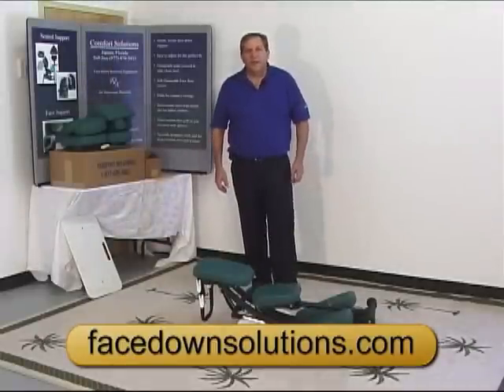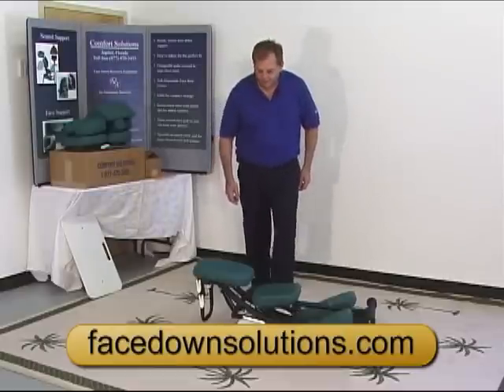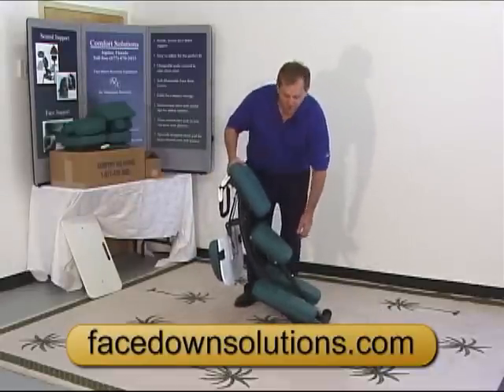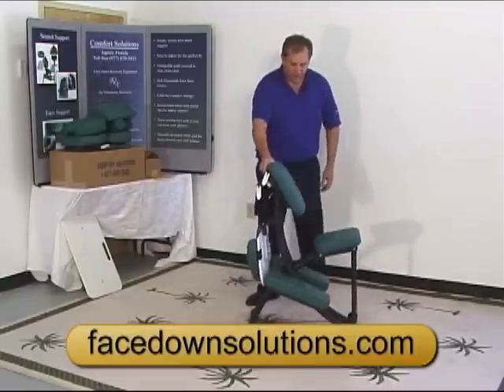Hi, Tom Russo with Comfort Solutions. I'm here to show you how to work with the chair now that we have it all unpacked. First thing we need to do is open it up — quite simply done, just lift it up, lean it forward, and lift up on the back of the seat. That sets the chair up.